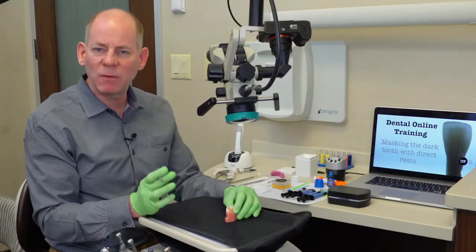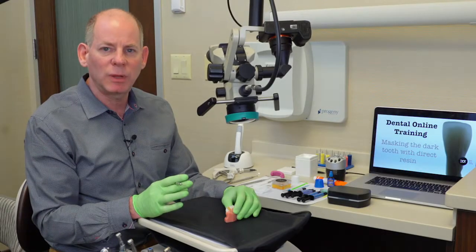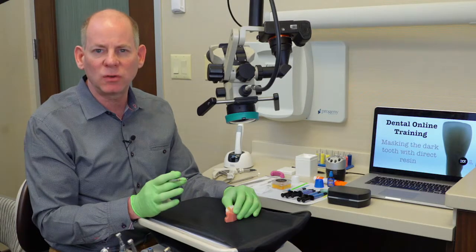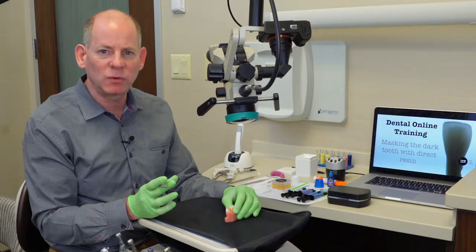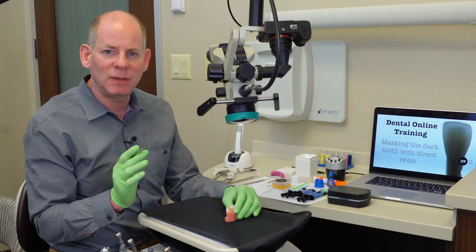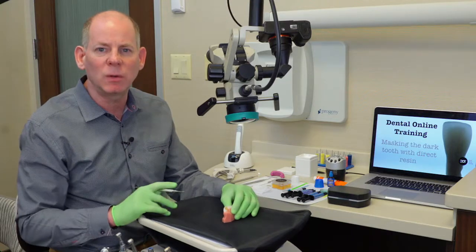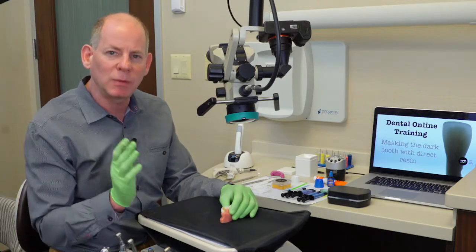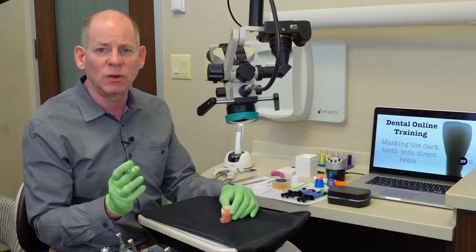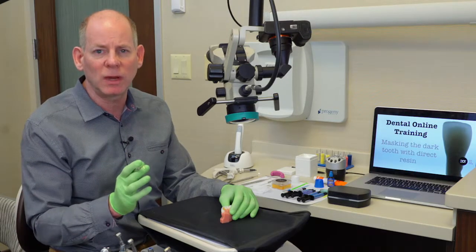Some of you may have noticed I don't have a mylar in place when I'm placing my composite — there is no wedge, no mylar strip for recreating the proximal surface. The key is that I'm using this IPC, a super thin instrument that allows me to move the composite and blend it in approximately without needing that mylar strip or wedge in place. I'll show you as we continue on.